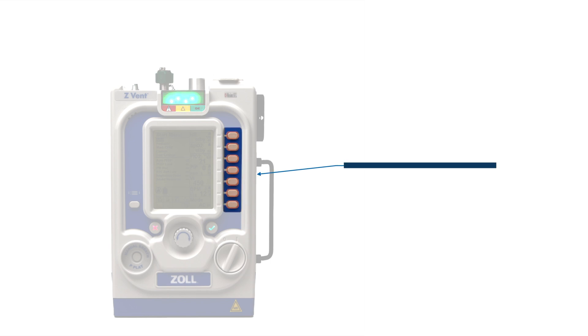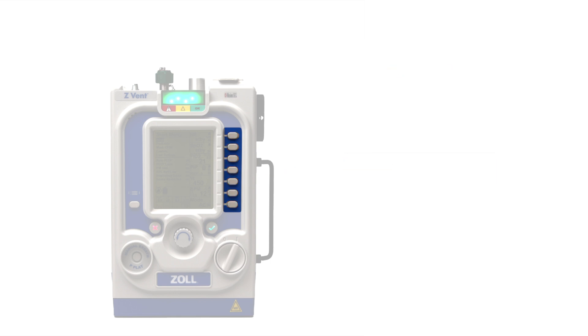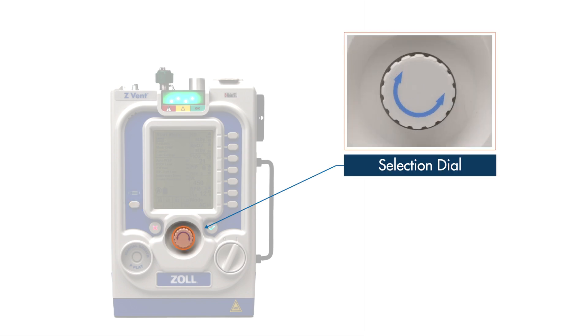Along the right side of the display are the seven parameter buttons. These buttons enable the user to access primary and secondary values and context menus to modify parameter settings. On the left side of the display is the menu button. This button enables the user to access the ventilator's menu to change core device settings and default profiles. In the middle is the selection dial, which allows the user to navigate the menus or adjust values for a chosen parameter.